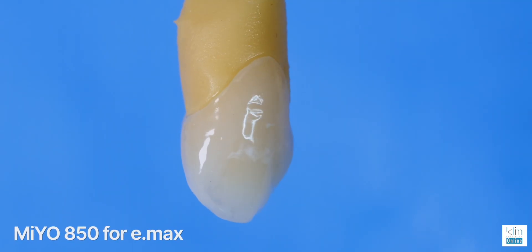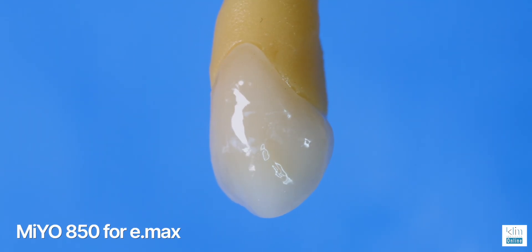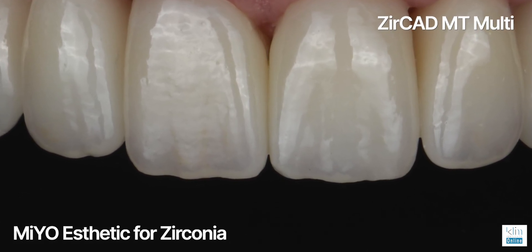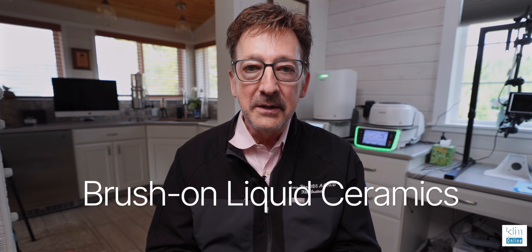Within the last several years, we've had what I call an enamel magic sauce with Mio, and that would be Mio 850 for Emacs — that's a lithium disilicate — and then also Mio Aesthetic, which is a lower fusing liquid ceramic where I can use that on multiple types of restorations, which would also be Emacs, Lucite, and Zirconia. These two options, Mio 850 for Emacs and Mio Aesthetic, are considered liquid ceramics.